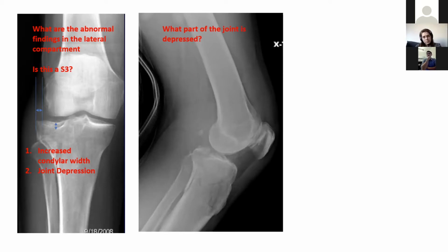All right, I'll take this. Looking at this lateral, it's a little blurry, but what I think I'm looking at is a concave surface that's involved. So my guess is that the medial plateau is involved on this one. That's what it looks like to me.